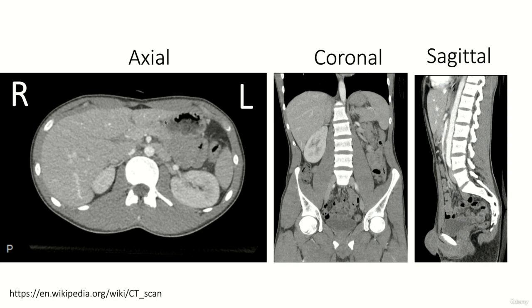Regarding the axial slice, you can see the liver here, that's the stomach. Here you can find the left kidney, this is the spleen, and this bright spot here is the spine. The spine clearly shows that bones again have a high image intensity due to their large X-ray absorption. In contrast, the lungs within the coronal scan have a very low image intensity as they are filled with air.